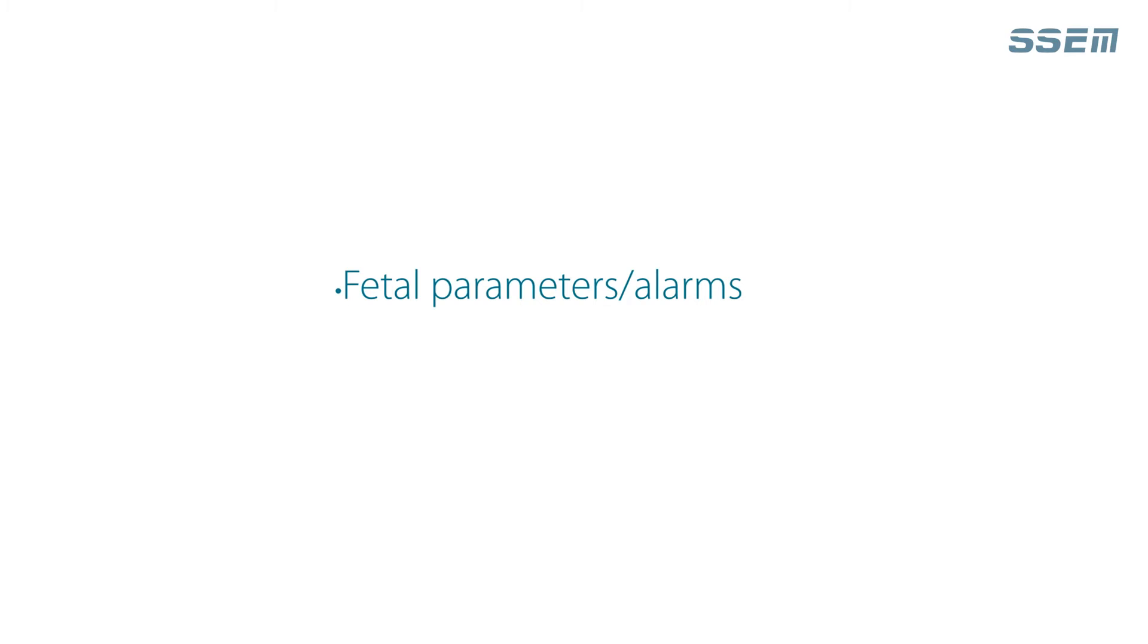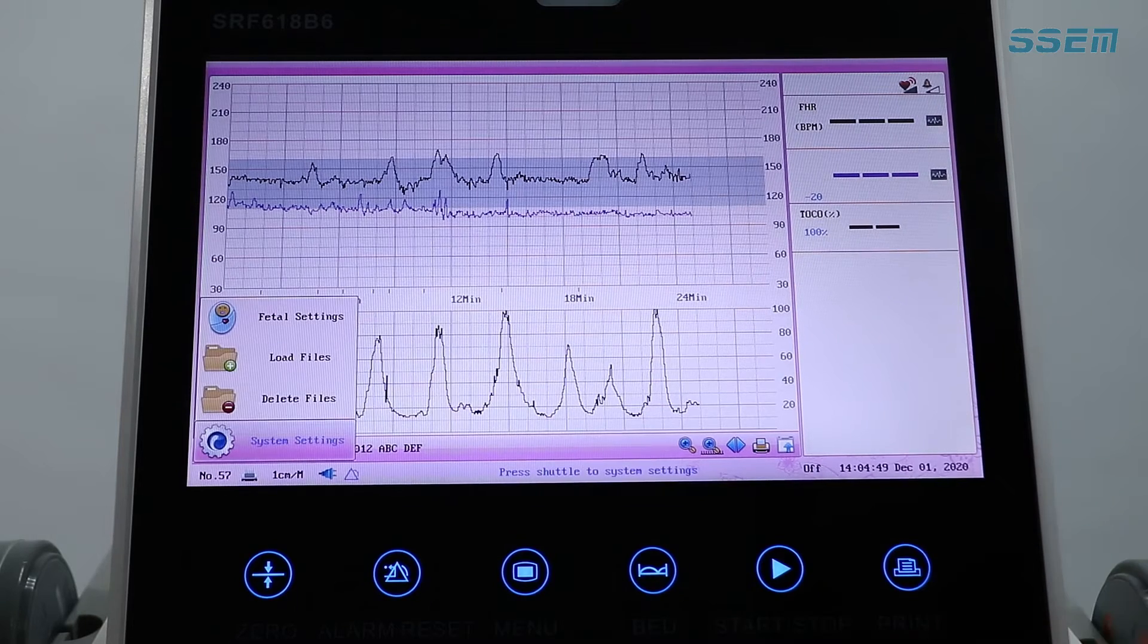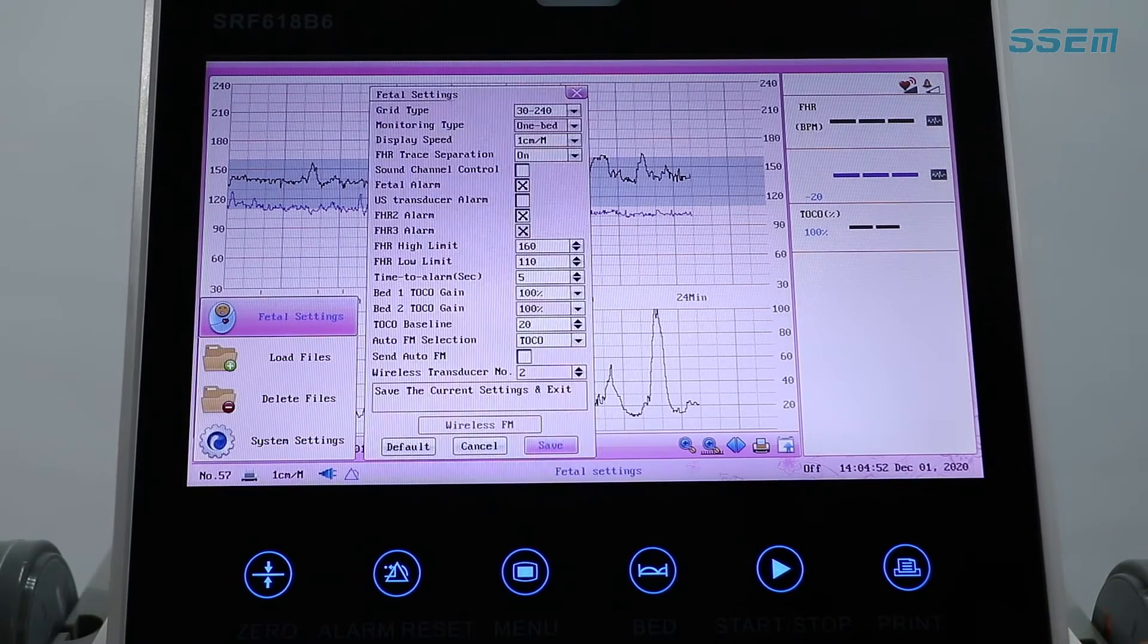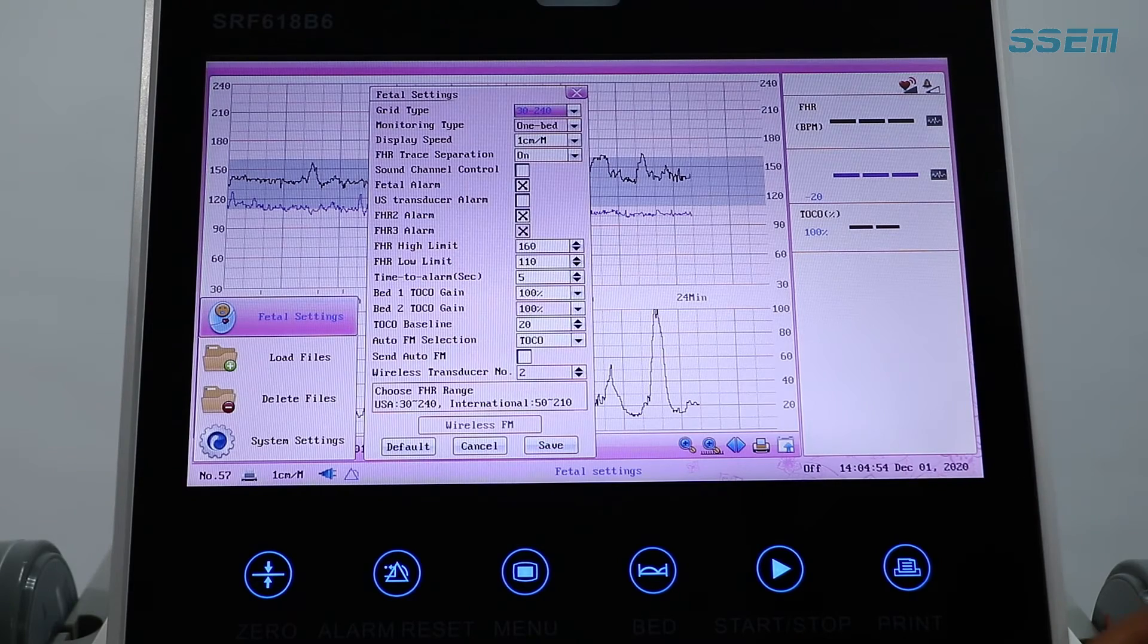Setting fetal parameters or alarms and ensuring that your screen display is the same as your printing time. Do this by press menu, go to fetal settings, change the grid type to 30 to 240.